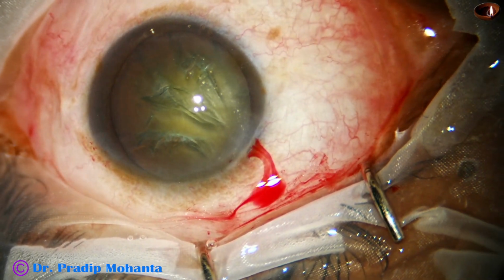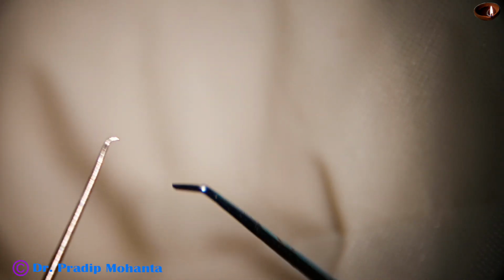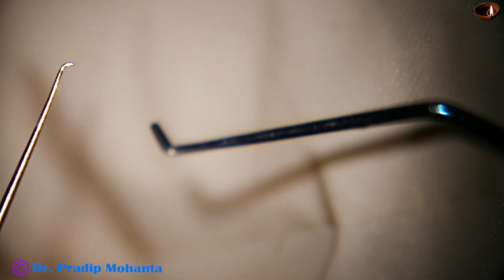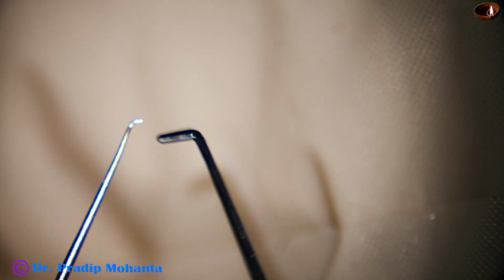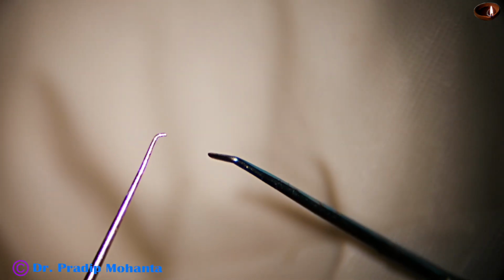And now let us see the Mohanta's Prechopper. This is the Prechopper. The front edge, the leading edge is sharp. Sharp means not razor sharp, it is just two surfaces beveled and they are thin, and the posterior surface is not beveled, it is totally blunt, the rear edge.